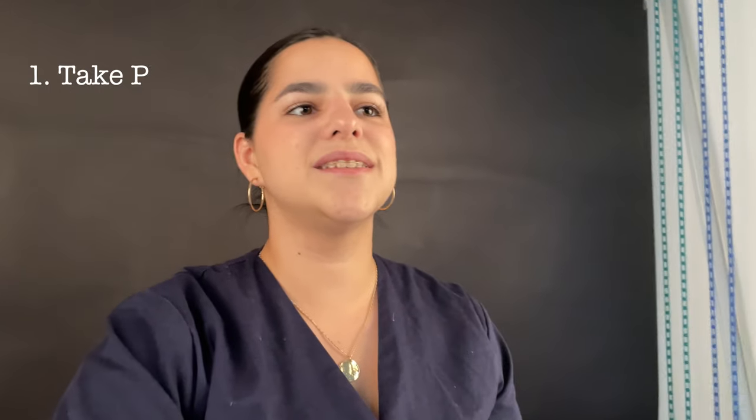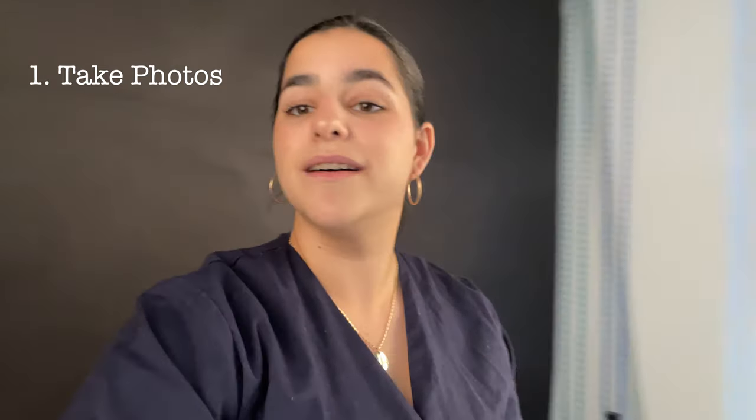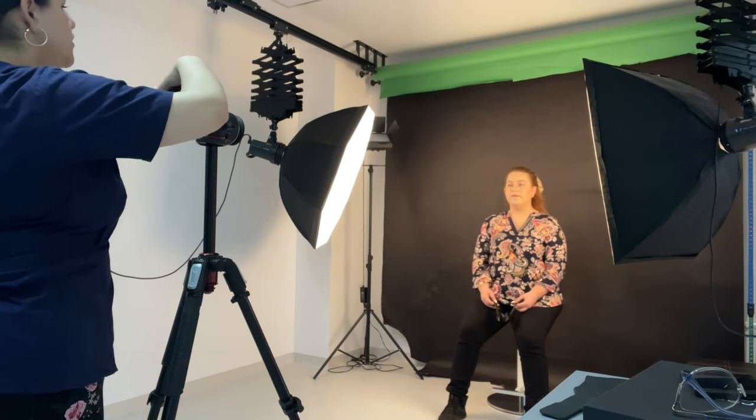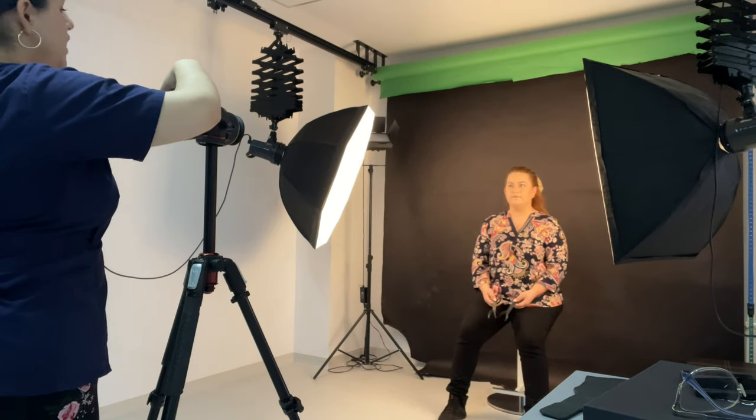Now she's calibrating the camera on me. We're going to take these pictures, so let's do that. Then we had to scan her whole arch so we can project a few things and make the DSD and other things. So we're going to show you that as well now.